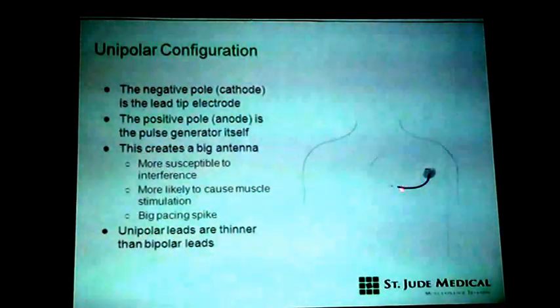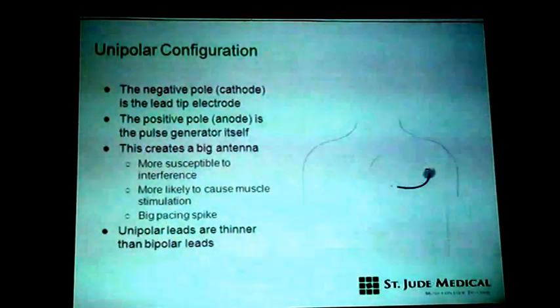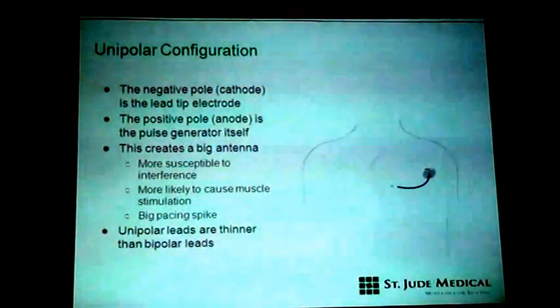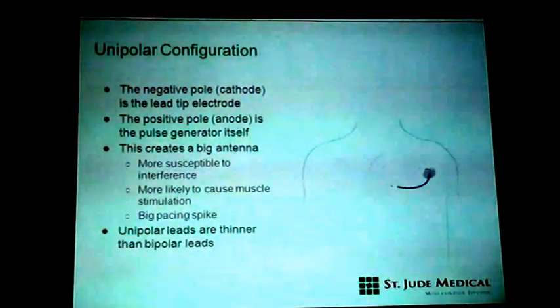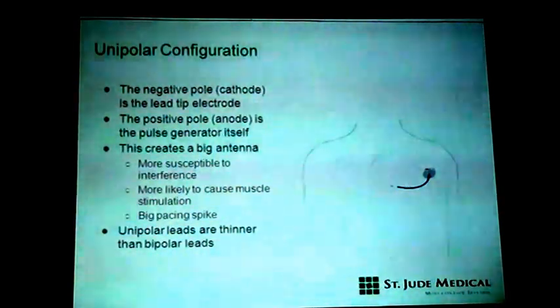Second, if you put both here, then the spike will be smaller. In modern pacemakers, we may not even be able to see the spike, unlike earlier. So general physicians and doctors who are following up the pacemaker should know the large spikes have gone.